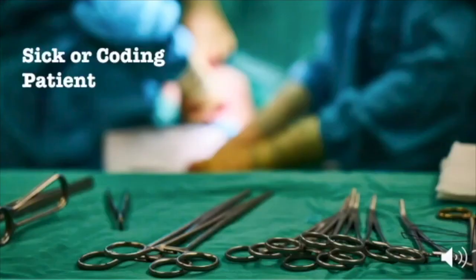Okay, so let's change this up for a minute. Let's say this time you arrive on scene, but the patient looks unstable. You hook up a 12-lead and see that they are in sustained VTach. They're diaphoretic, short of breath. They just don't look very good. This patient has an LVAD. What are we going to do with them?